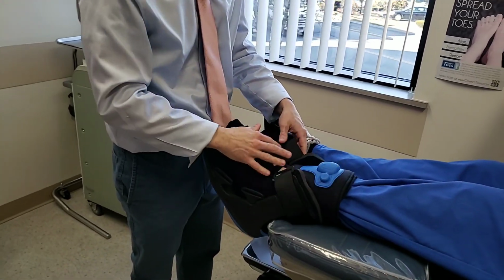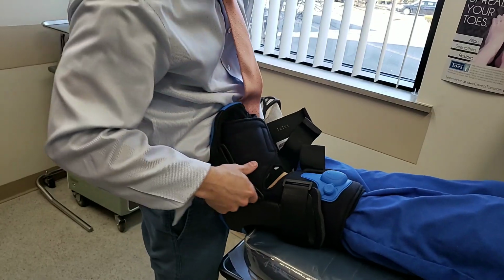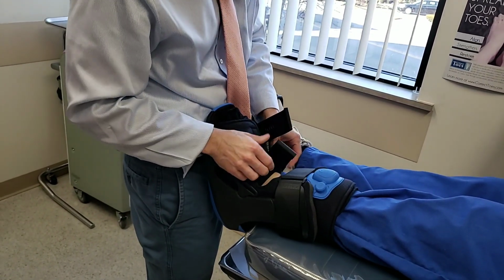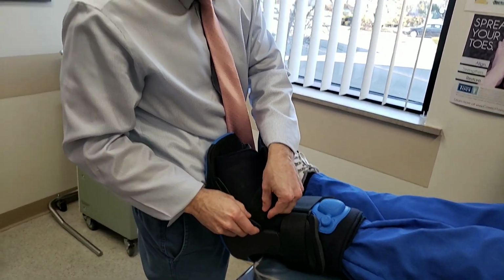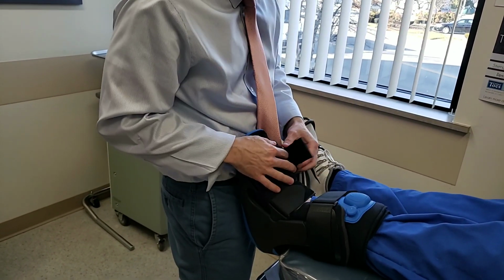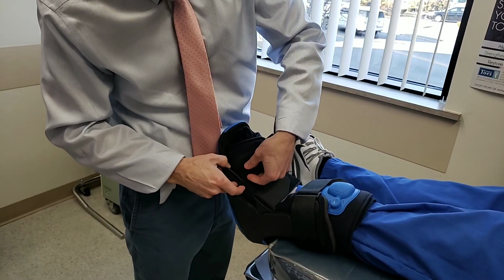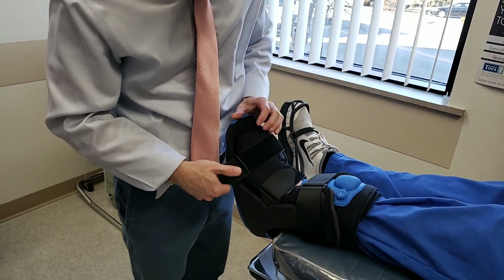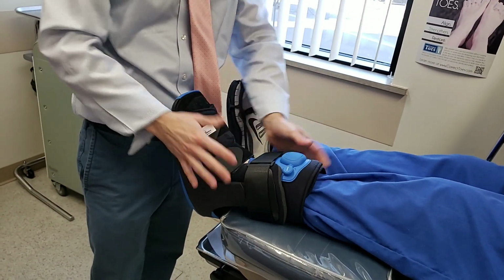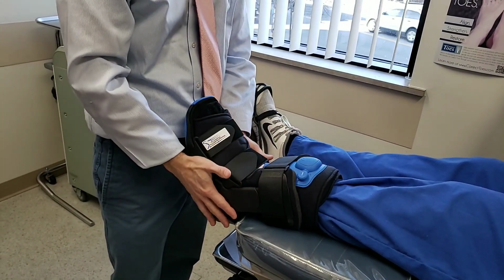And then you could add any pads that you would like, let's say if it's rubbing here. And then you strap down. Now, if you have any numbness or tingling with the boot, you would want to loosen it up, because sometimes if it's too tight, it can cause some numbness on the foot or it's uncomfortable. Then you can pump it up if you want to give it a little bit more support, and if you want to get rid of that air, you can push that. So this is just one type of boot.